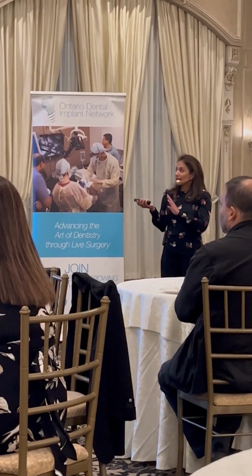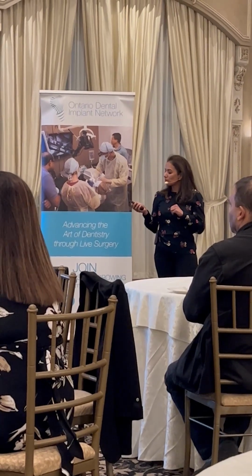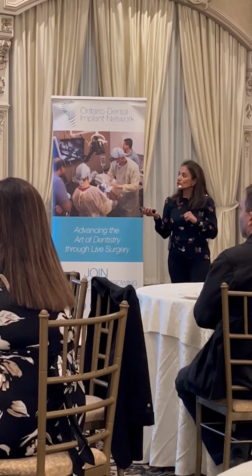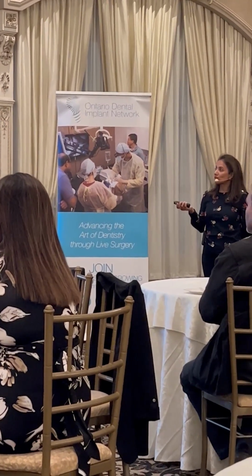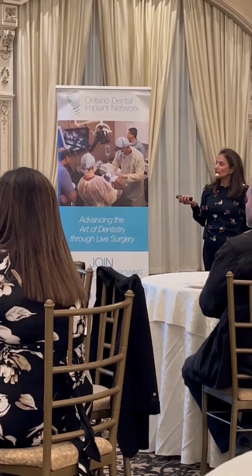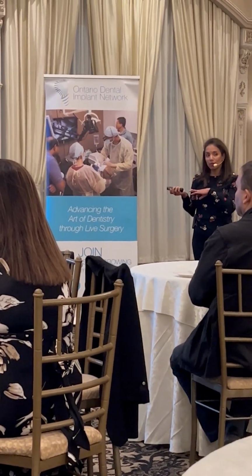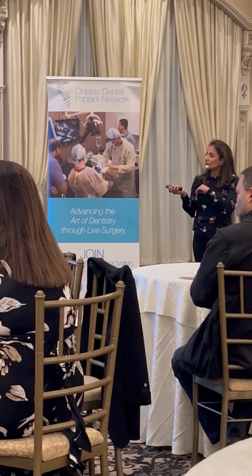I usually love taking pictures on the day of surgery, 1 week post-op, 1 month post-op, and 4 months. At 1 week post-op, what I usually like to look for is the sutures, whether they are in place, the oral hygiene. Stress with the patients not to trouble the immediate area site, keep the tongue away, at least for the first 6 weeks. Check on the healing abutment.